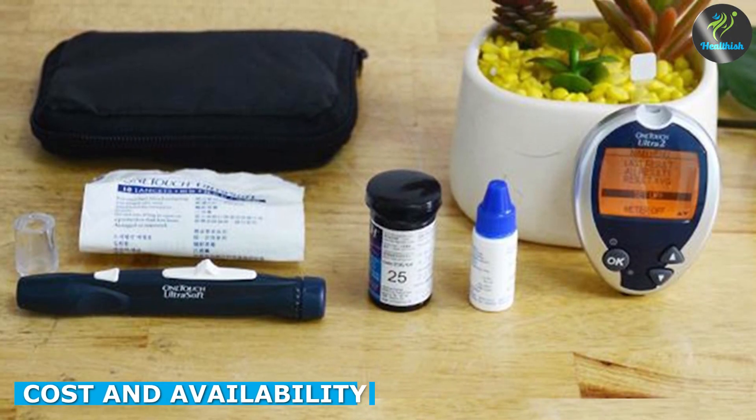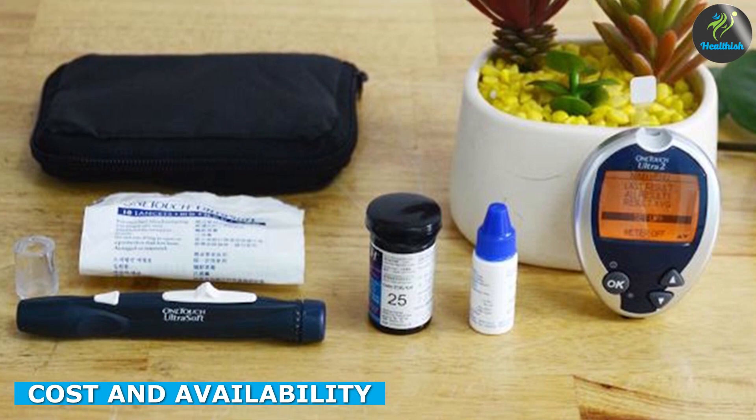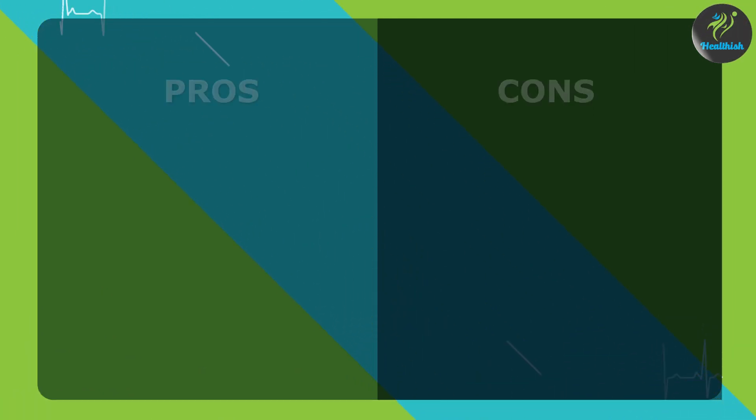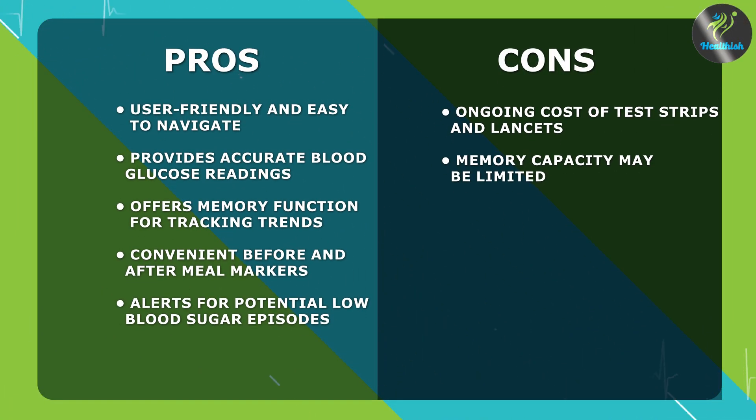Let's talk about the cost and availability of the OneTouch Ultra 2. The meter itself is typically available at pharmacies, online retailers, and through healthcare providers. The cost may vary depending on your location and insurance coverage.